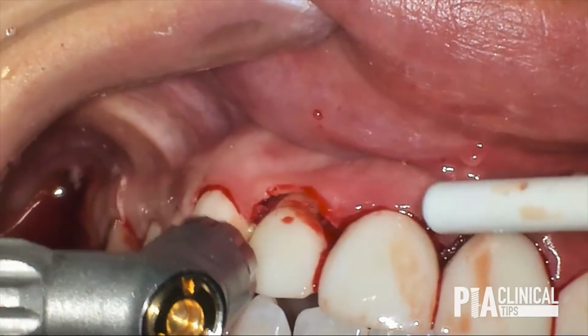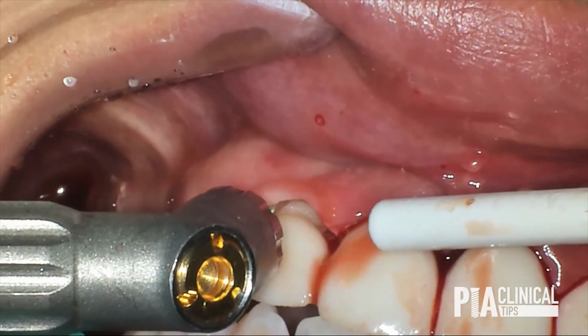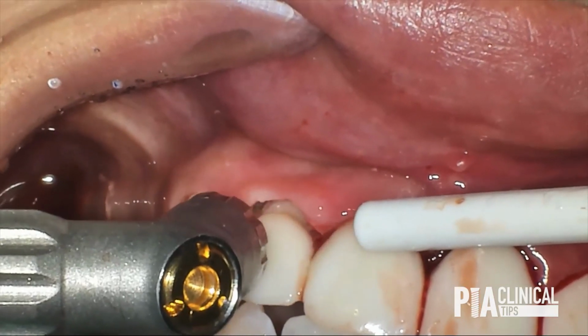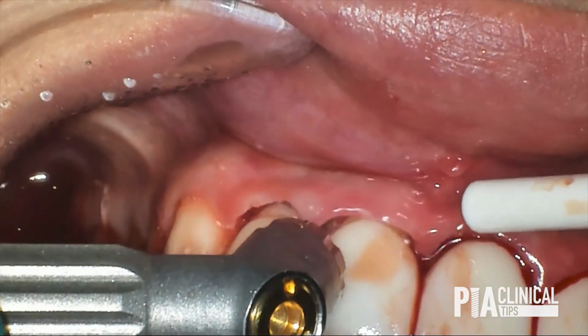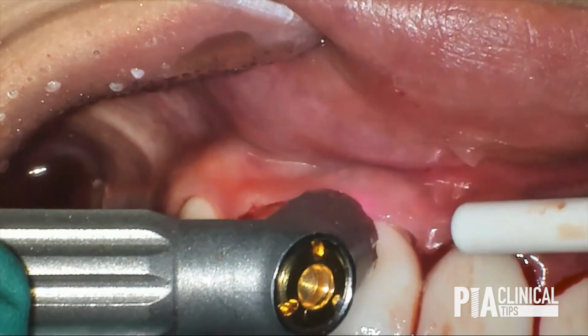We use this in a way so that we create that biologic width that we talked about, that 2 to 3 millimeter space below the crown or veneer restorations. You can see here the margins of the restorations and a space that we're creating in order for the body to have that type of breathing room.